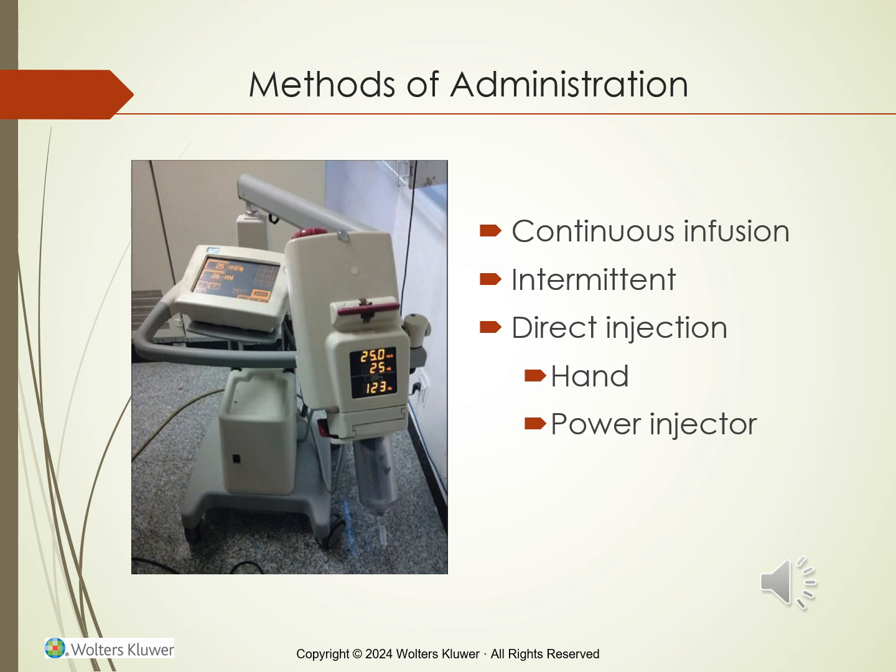reaction from worsening. Intermittent infusion is similar but involves adding medication through a secondary IV, usually to control the amount given, especially to children and elderly. Another method is direct injection or an IV push, where medication is slowly injected over 1 minute into an existing IV line or port. This quickly raises medication levels in the bloodstream, affecting the heart, brain, as well as kidneys.